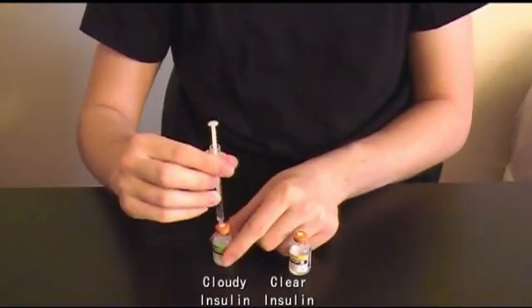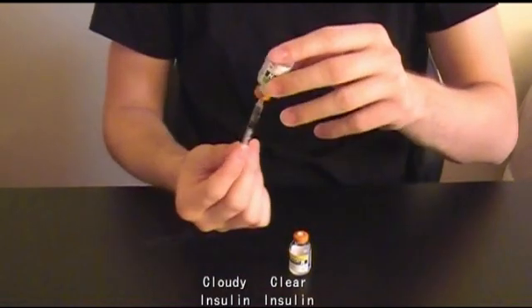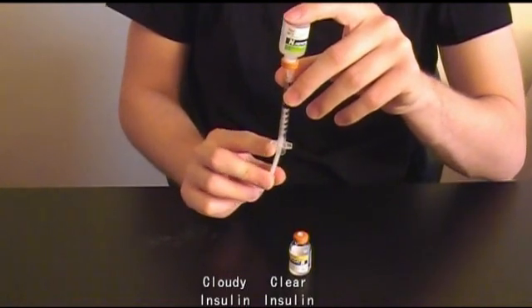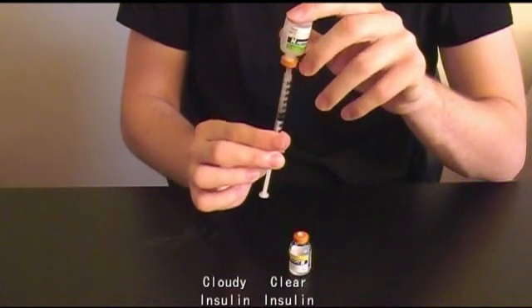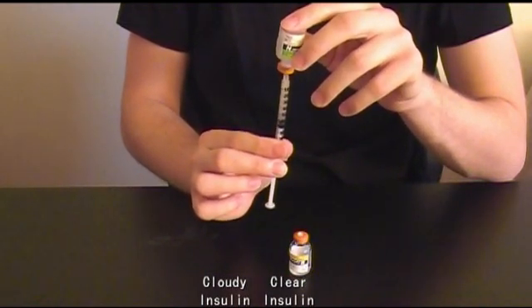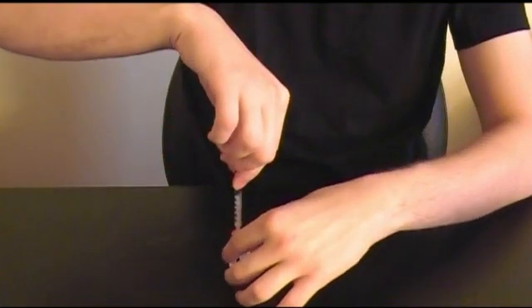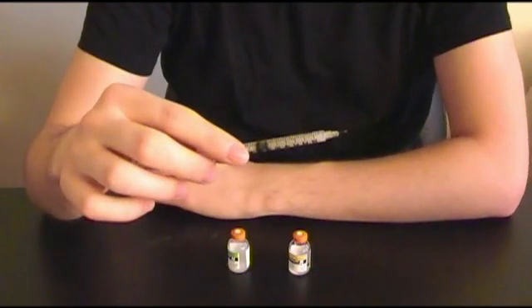Now insert the needle at 90 degrees into the cloudy insulin vial. Do not push the clear insulin into the cloudy insulin vial. Flip the vial upside down and withdraw to the total number of units needed for this injection. For example, if you require 10 units of clear insulin and 15 units of cloudy, you would withdraw the black plunger cap to the line marked 25. Flip the vial right side up and remove the needle from the vial.